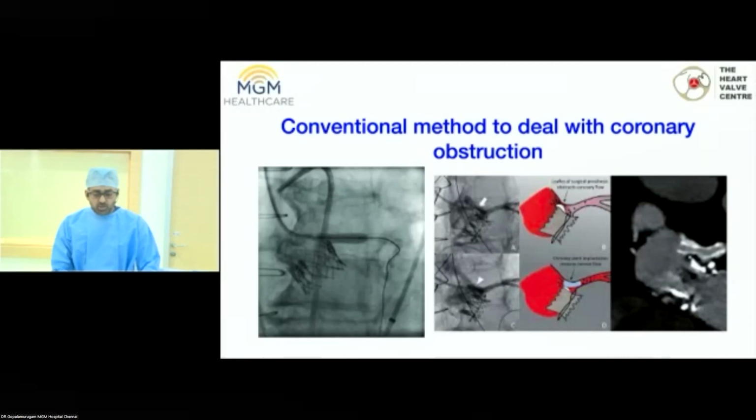Of course, what are the options? The conventional technique has been doing a chimney. You can put a stent, very well established, and that works perfectly fine too. But then chimney stents come with their own problems. You can have a stent problem, and then it's a nightmare to get back in there.